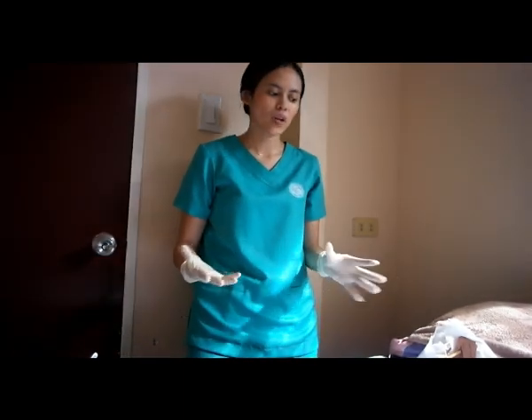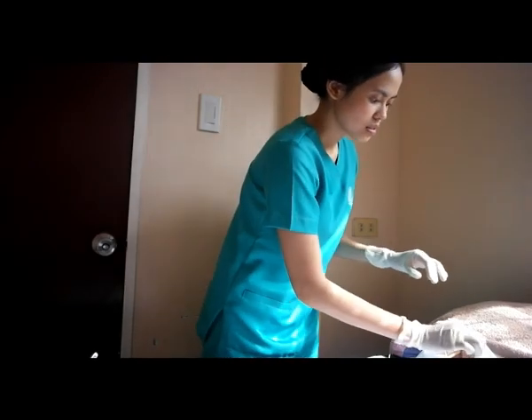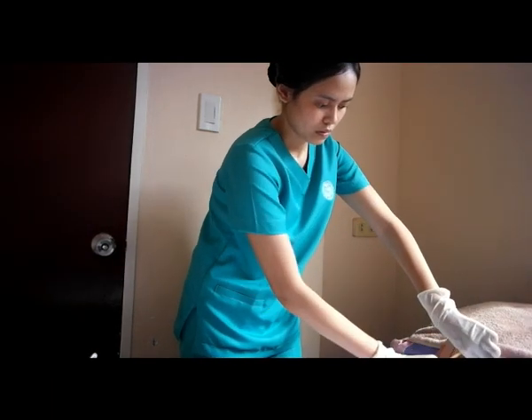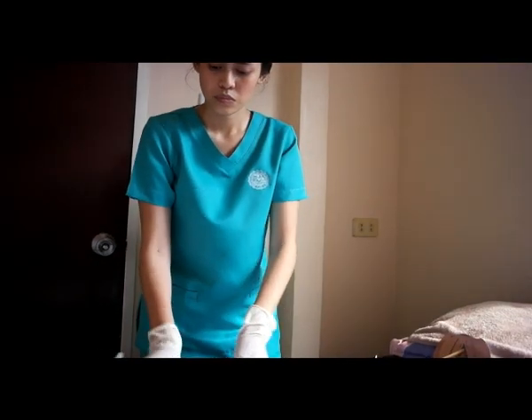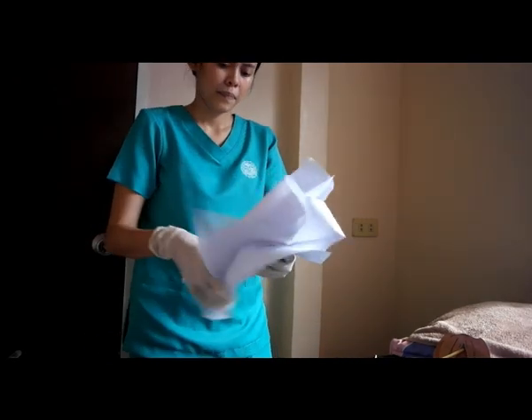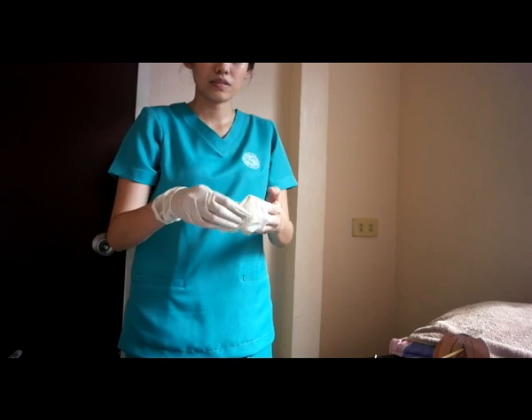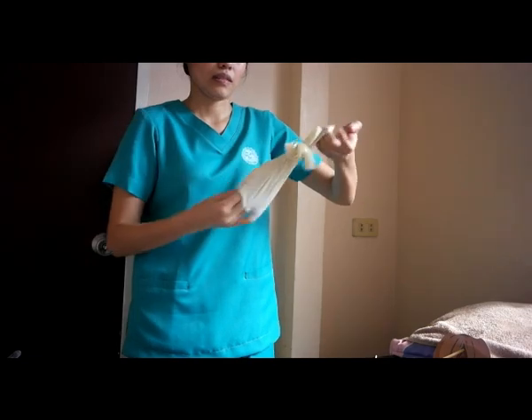Before taking off my gloves, I will be removing first the drapes and the pads and the sheets. Throw that to the bin. Then removing the gloves. Right there.